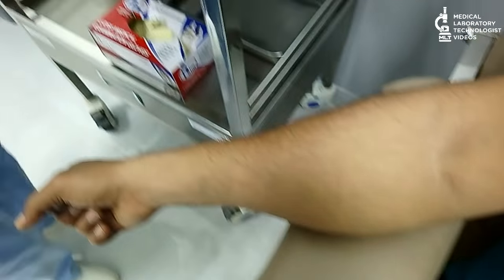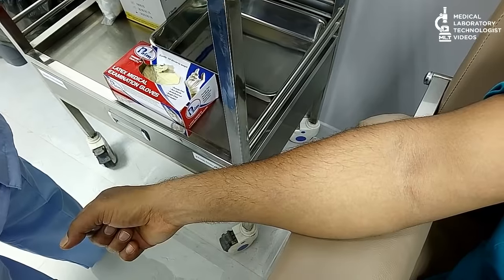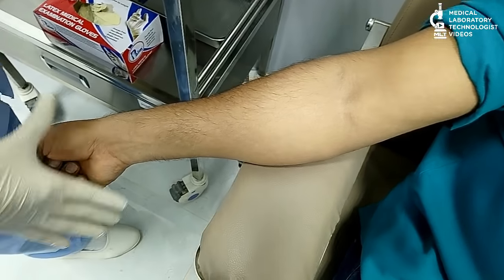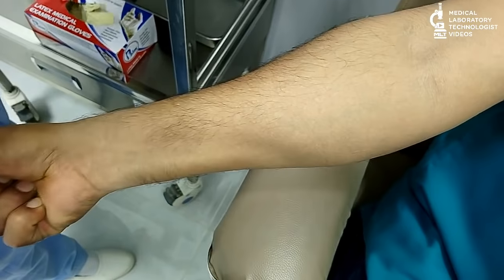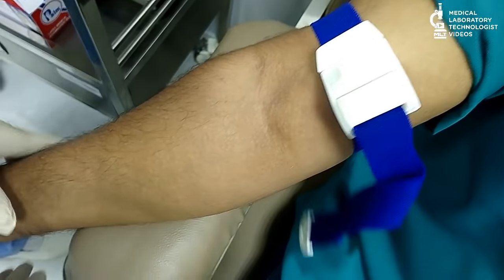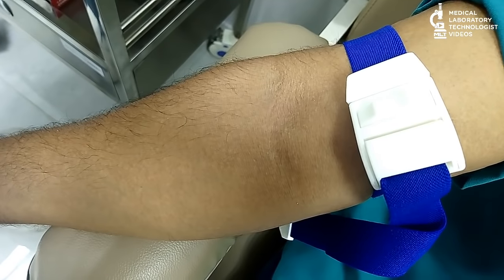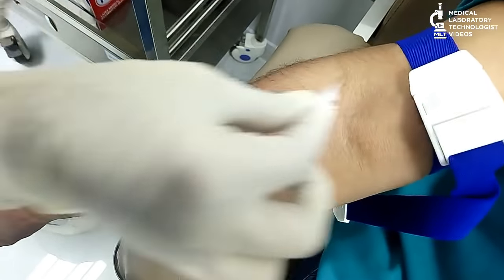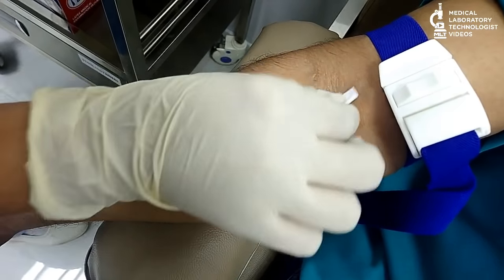Then, put on the gloves. Tell the patient to keep the arm properly and make a tight fist. Then, put the tourniquet above the upper arm. Then, find the vein. Take one alcohol swab and clean the area.